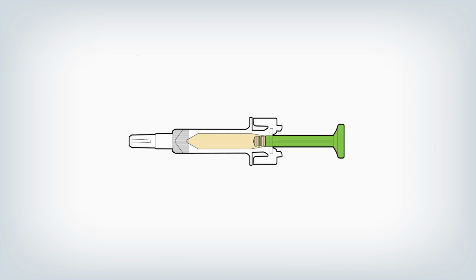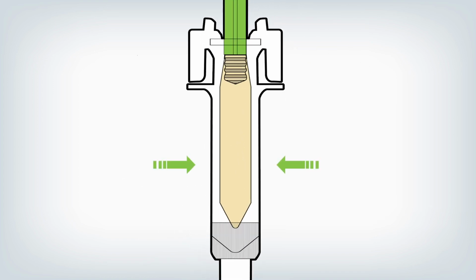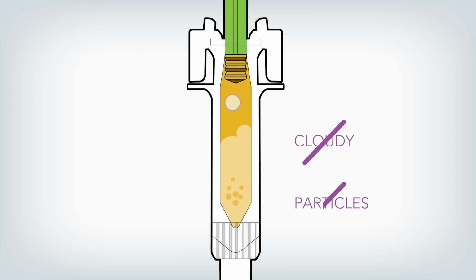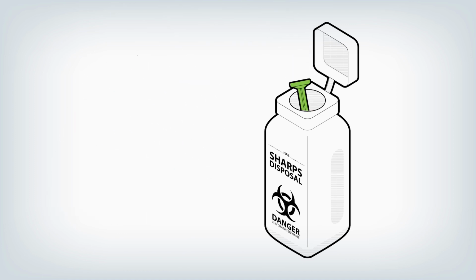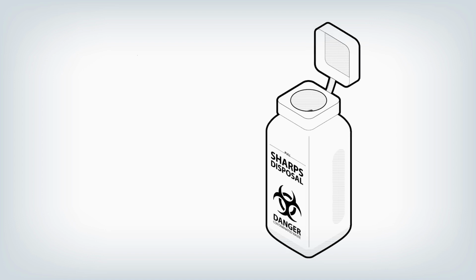Make sure the liquid in the prefilled syringe is clear and colourless to pale yellow. It is normal to see a small air bubble. Do not use if the liquid is the wrong colour, cloudy, contains particles, or any part of the prefilled syringe appears to be damaged. If this happens, safely dispose of the prefilled syringe in a secure, puncture-resistant disposal box, also called a sharps container, and take a new one from the refrigerator.